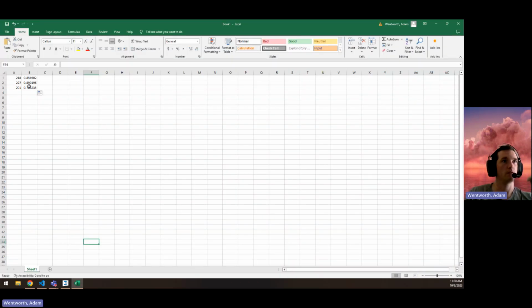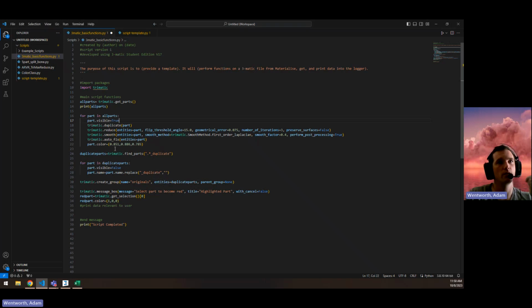So if you go into Excel, you can do that and just type out your RGB values, write a formula that divides by 255, and then these are the values that you want for RGB. So just type those in there. If you want to color any object, part.color equals R, comma, G, comma, B in parentheses.